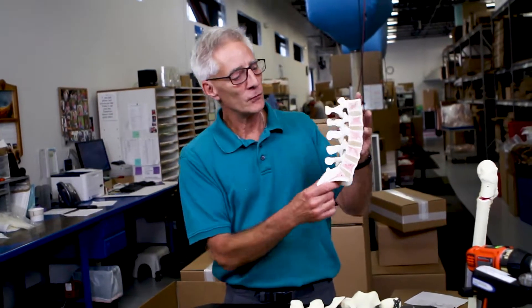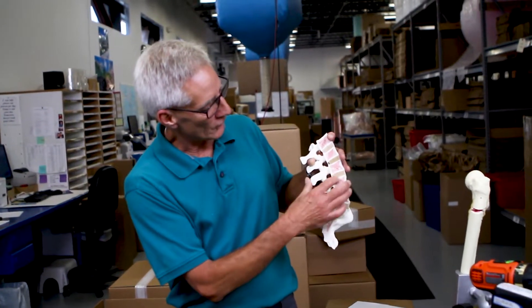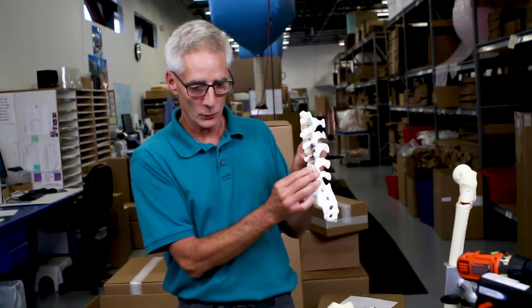It's also useful for doing pedicle screws. As you can see in this cross section of the lumbar spine, you can see the cancellous material throughout each vertebral body. This is absolutely a must if you're going to do any type of pedicle screw fixation.